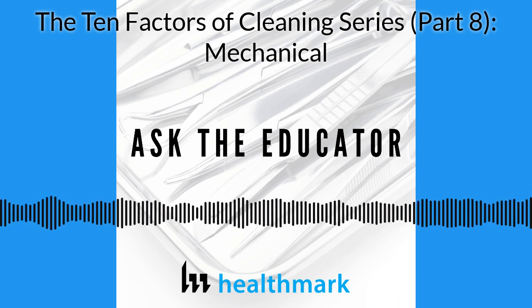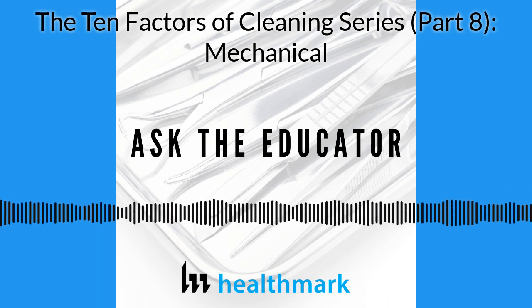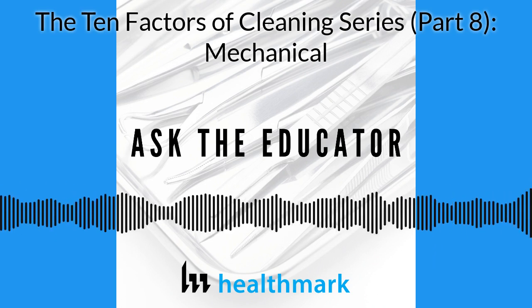And if you've got a problem, you're not going to get the same pressure to go through those lumens and so on. So you really got to know if you've got 1 pump or 2 pumps. Does it have cavitation and so on? There's a lot of things with that sonic, right? You've had all different types, Kevin, correct? Yeah, that's absolutely right.